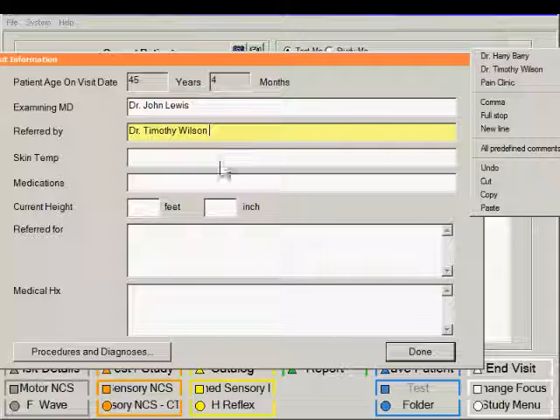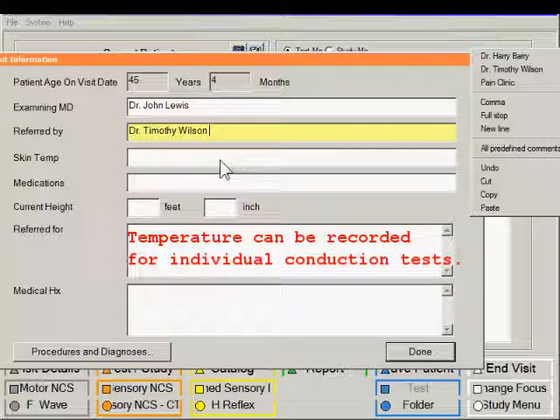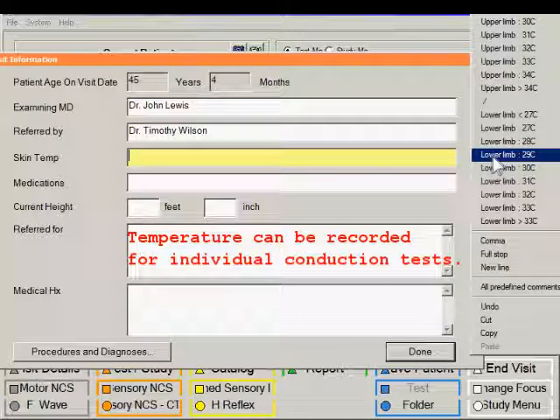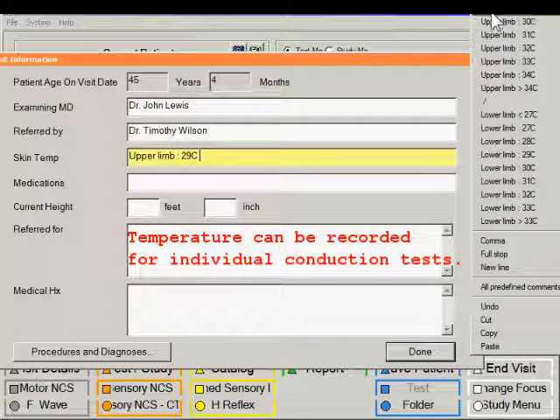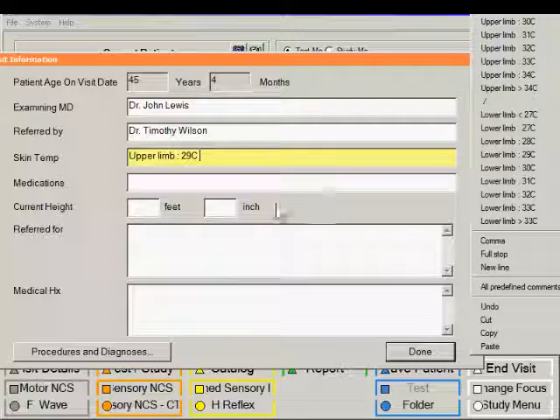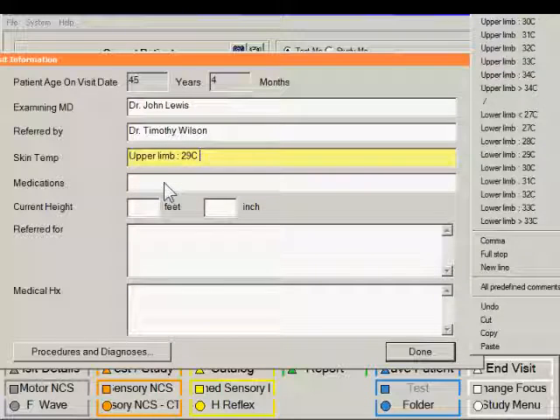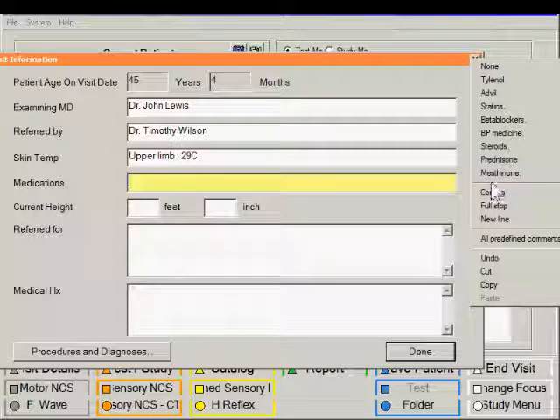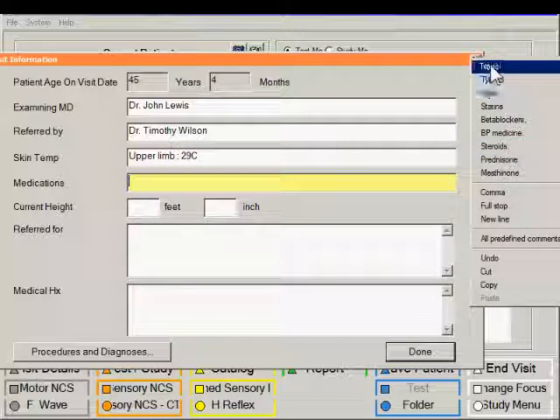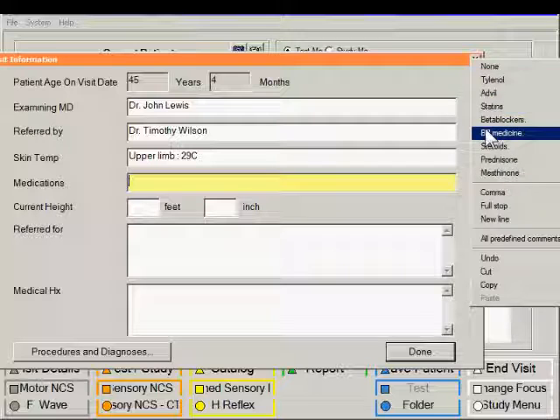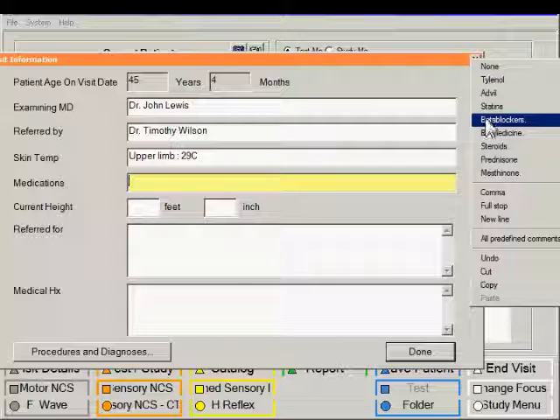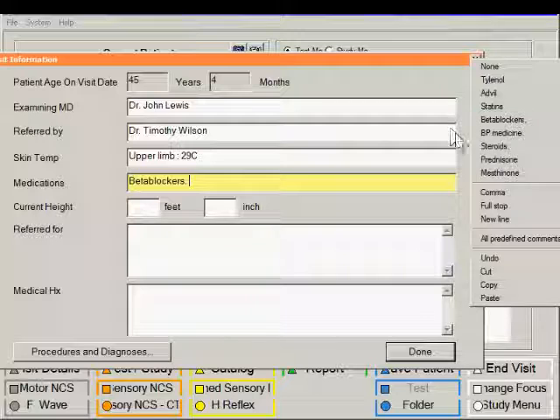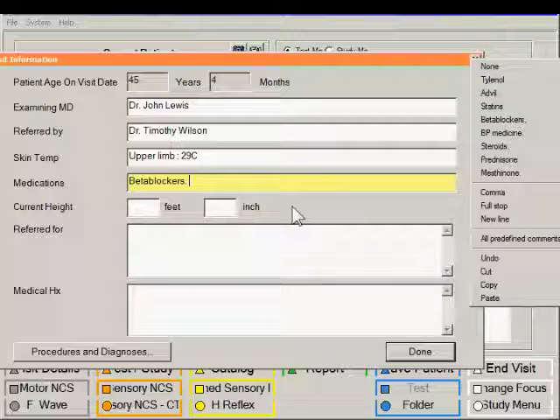For skin temperature, right-click and a pre-measured skin temperature can then be entered. For medications, there is a list of drugs that you can select from. If the drugs that are necessary to be entered here don't appear, then you can hand type them in.